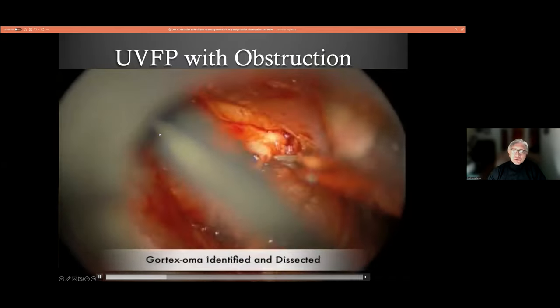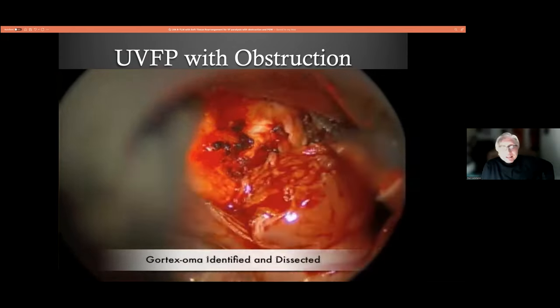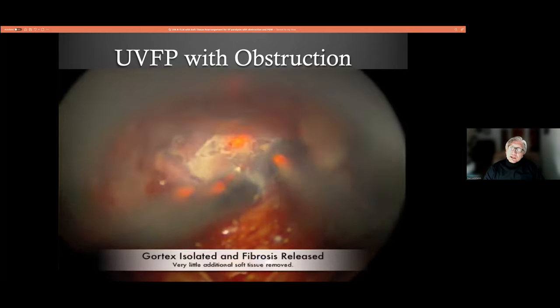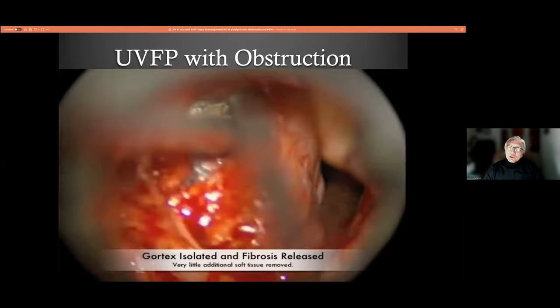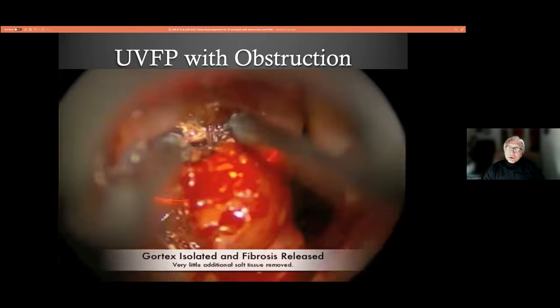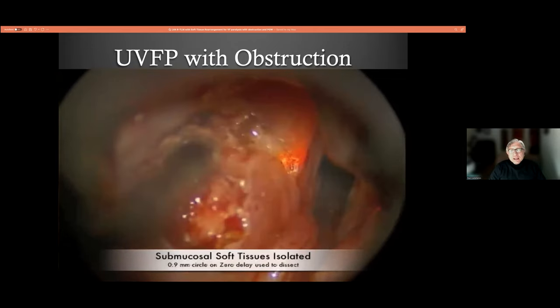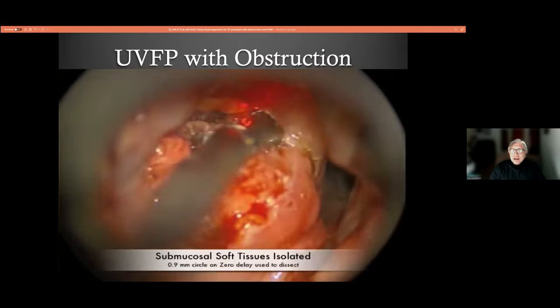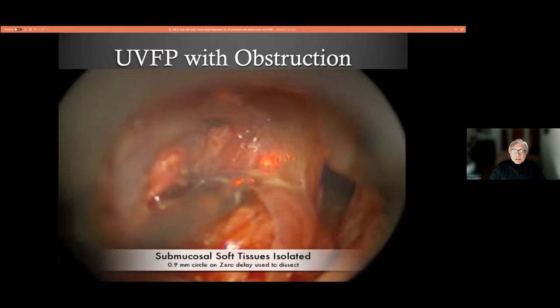So this is the tissue that I'm harvesting as the graft material, since I'm removing the Gore-Tex. Dissecting down to where the Gore-Tex was, by the way, was extremely challenging, and eventually I got to it and managed to take it out. I don't actually recommend placing Gore-Tex as a medialization material transorally. One of my dear colleagues and former protege has developed a technique for doing this safely transorally, and my hat's off to him. He's innovating as I hoped he would. And yes, there is a way to do this. I hope it will be available sometime in the next year or so.